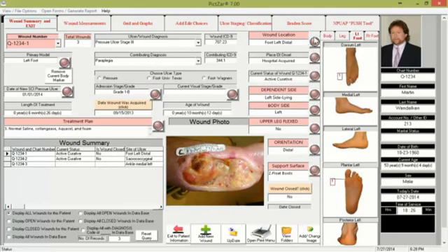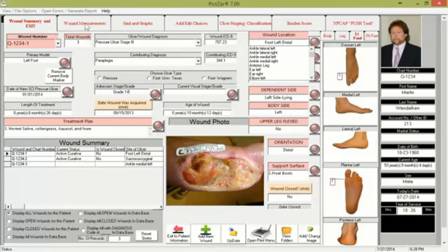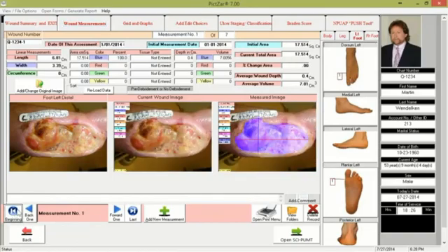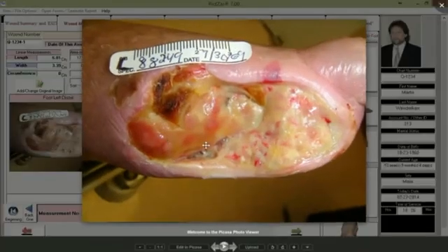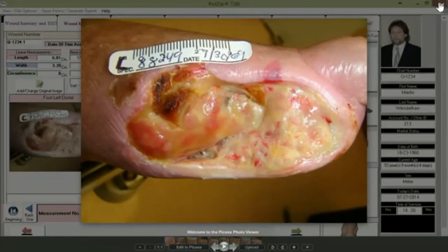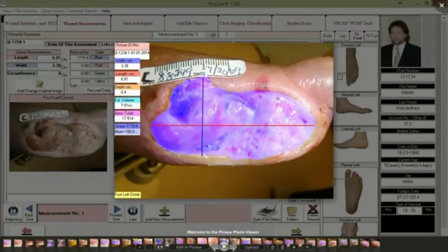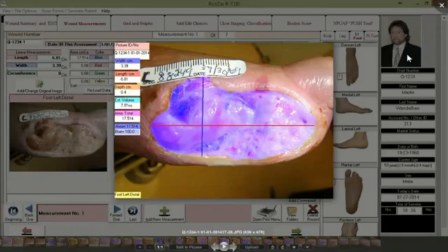Let's now spend some time on the second tab, known as the wound measurement tab. The wound measurement tab contains the data for the wound and also contains the pictures of the wound at the time you measured them. Here you see three images: the baseline image, the current wound image, and the measured image. If you click on the image, it opens in your default viewer — in this case Picasa — or you can click on the measured image to open it enlarged in Picasa for a better look.